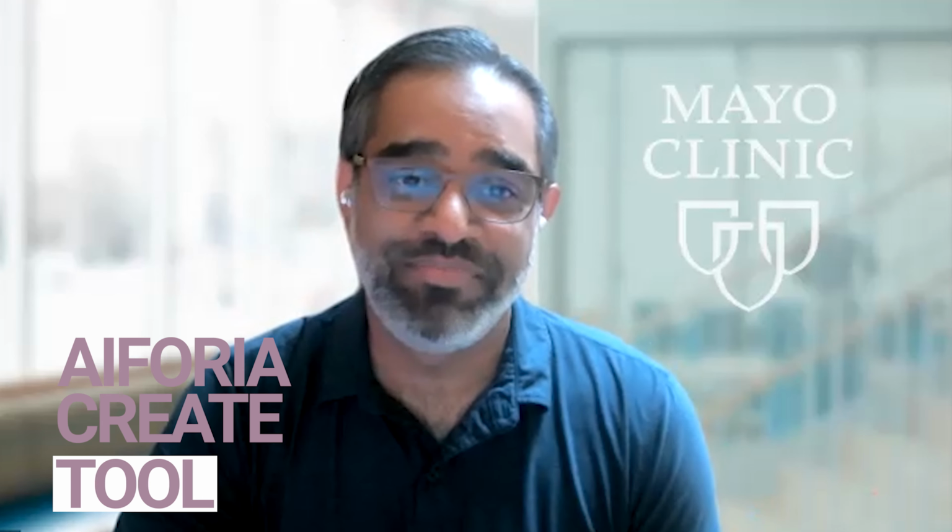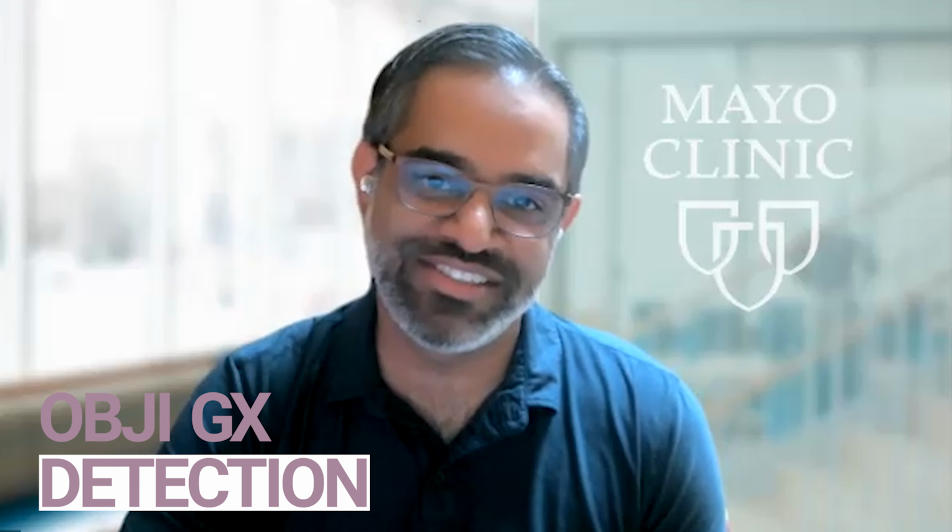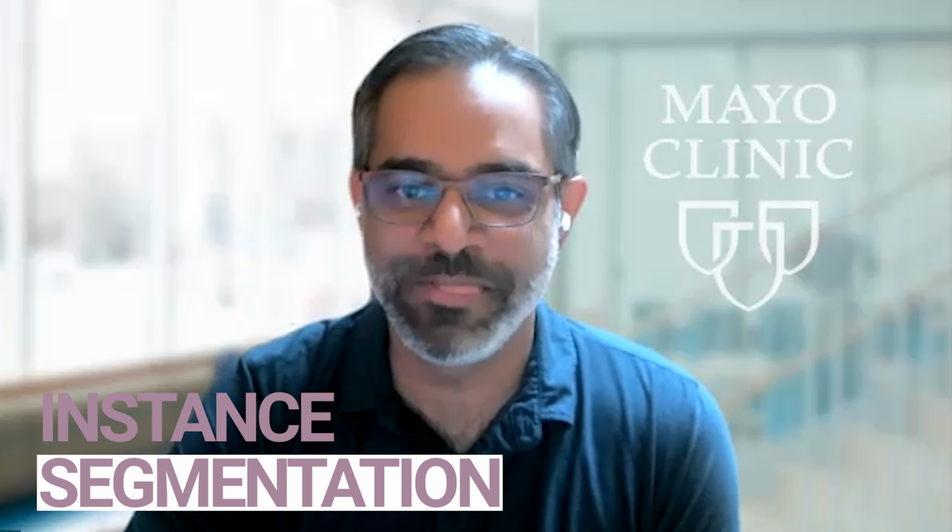But they also had the Aiforia Create tool, which I didn't know much about, and that was the meeting I set up way back when to go over what kind of tools are there. It is an easy tool for pathologists to use. It's non-coding, so you don't need any coding experience to do this, and it's basically a tool that allows you to annotate regions that you want, and you can do region detection, object detection, instance segmentation.